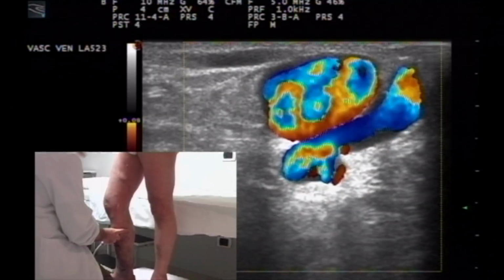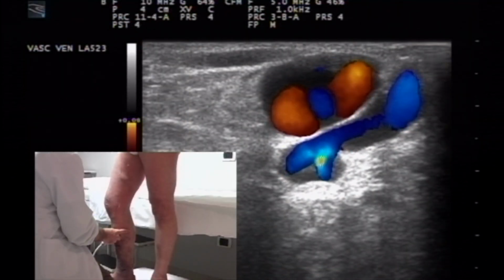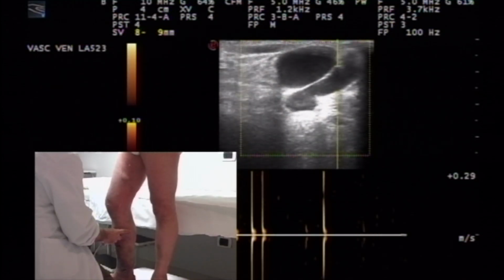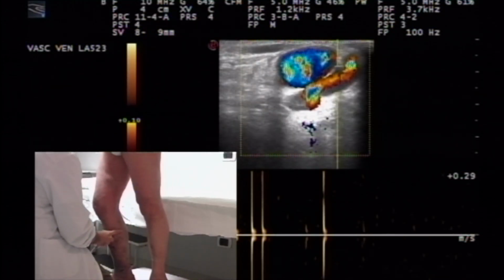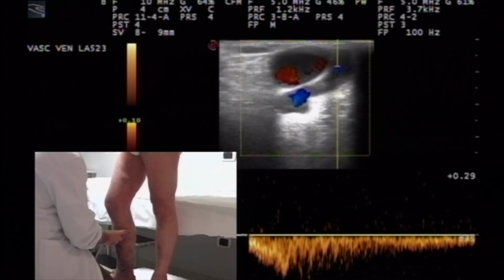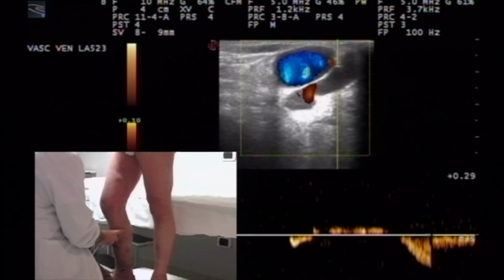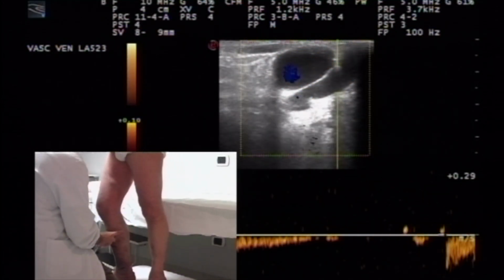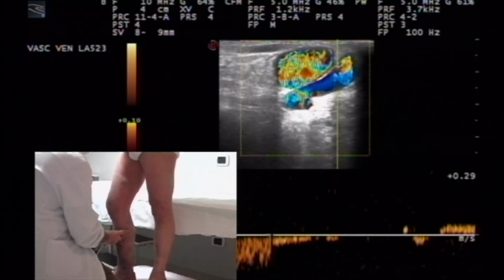Systolic reflux in a perforating vein upstream of the calf muscle pump is pathological but not pathogenic if followed by a prevailing diastolic inward flow, or in the presence of an N3, 2 and 1 re-entry downstream in the respect of the normal direction of venous flow. And so this perforator can be considered a re-entry point.